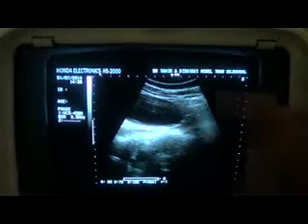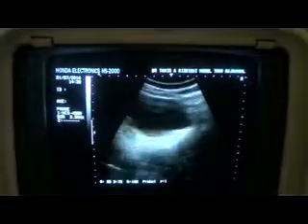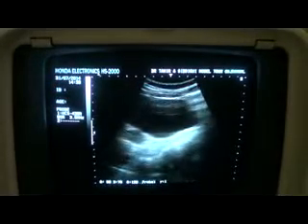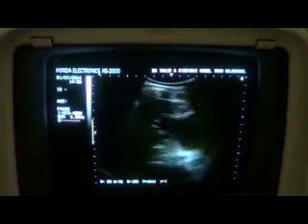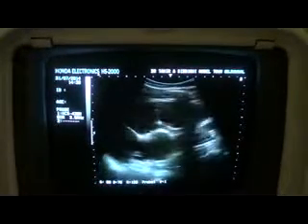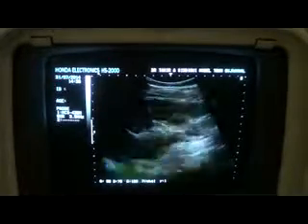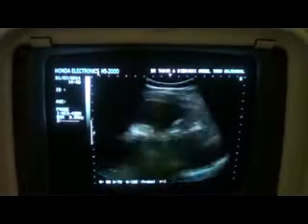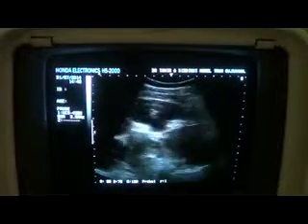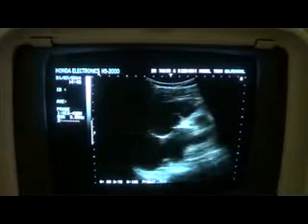this area, you see, at the region of PUJ, pelviureteric junction, and this is the dilated pelvis of the right kidney, and these are the dilated calyces. No parenchyma visualized. The outer surface or the capsule is intact. No calcification or focal lesion is seen in this kidney.